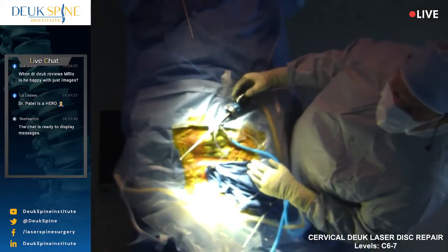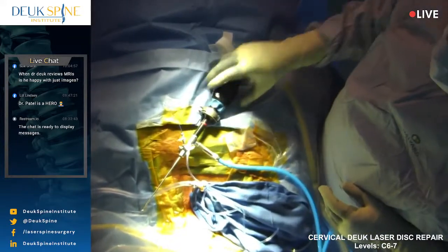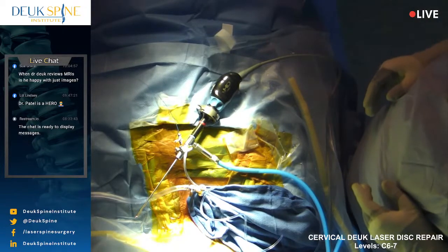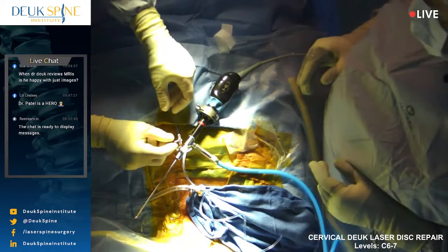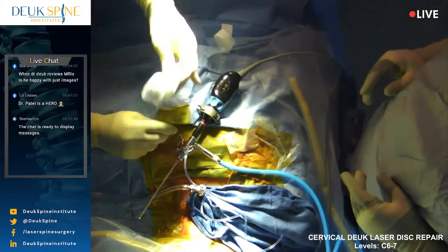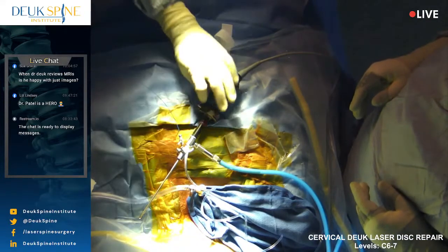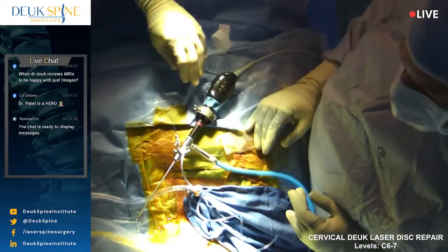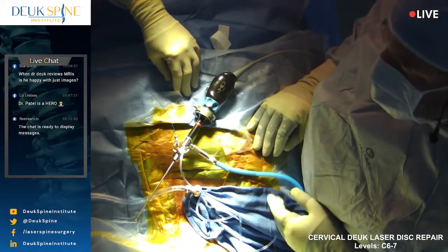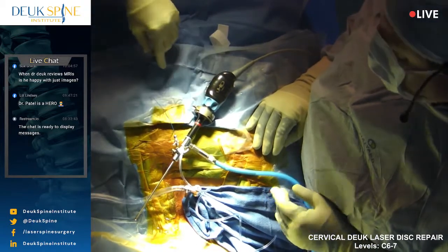And it's wonderful. How are we doing over there, guys? So the scope is down. Do we have to white balance? We have to white balance right now. How come we haven't? This is like the second time this has happened. What's going on? Normally you white balance. What's the problem? Why are we having this, Luis? Is there a software issue? Is it a human error? Is it a machine error? What is the error? Can you turn off that and put it back again, please? Luis, is it just it was forgotten to do, or? Oh, okay, all right. Turn off, please.